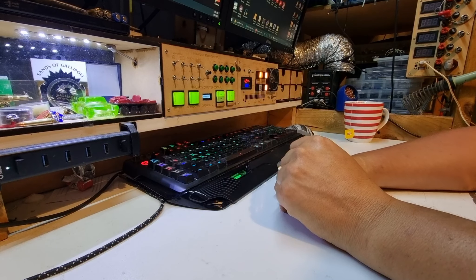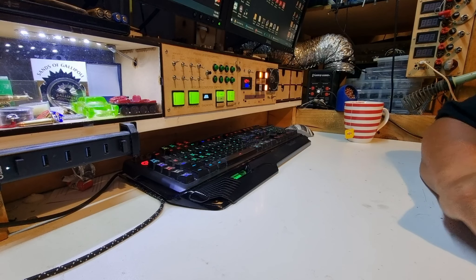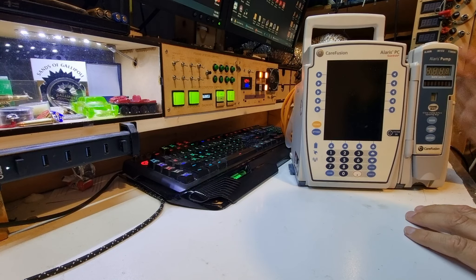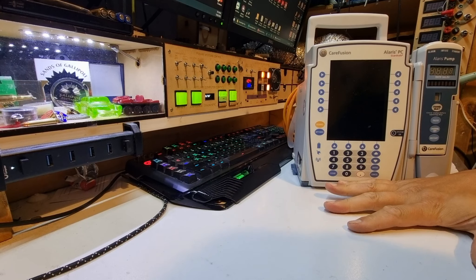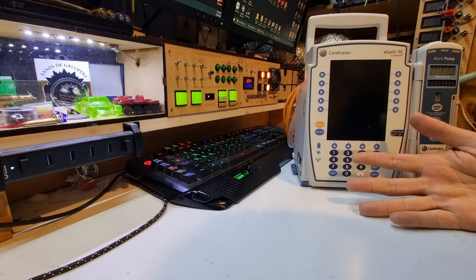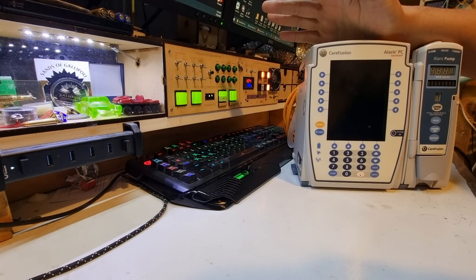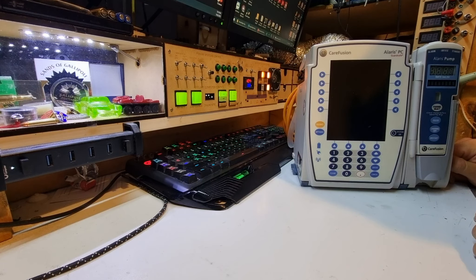Welcome back to another video. Today we've got some stuff to fix, so we're doing a desk job. We've got a couple of these Alaris IV machines — there's a blue one over here too. Now before we get going, we're not going to be using these on people; if they were, this would be going to a proper authorized and accredited service center. These are from a local animal aid center that deals with injured wildlife and they're entirely funded by volunteers.